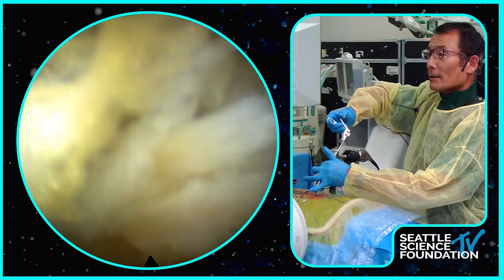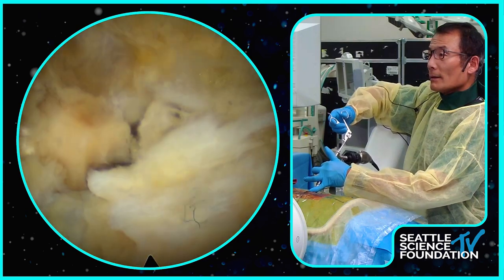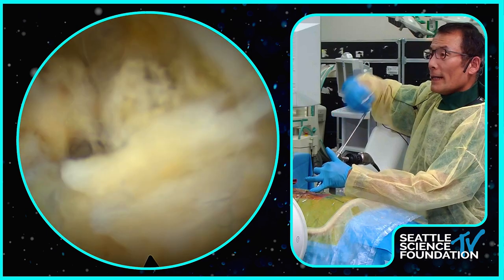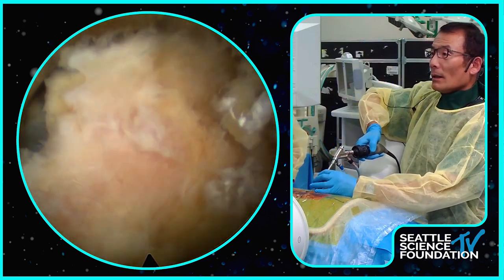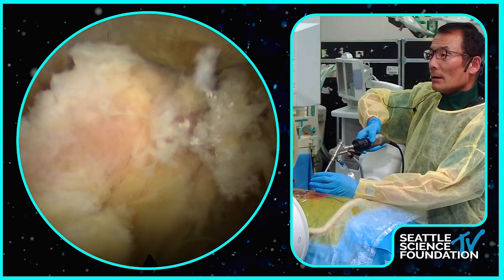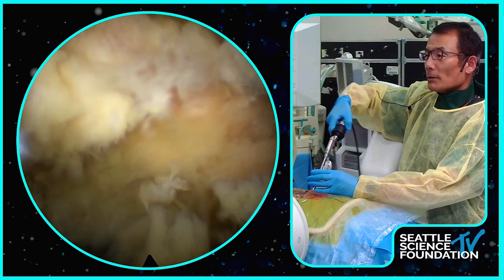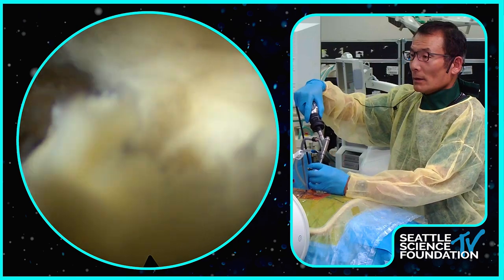Shin, quick question. On your ipsilateral side decompression, you showed us the exiting root. So that meant you resected a fair amount of the SAP to be able to visualize that. Can you go back? Show us the top of the L5 pedicle, if you would, on your ipsilateral side. So we can get an estimate of how much of the SAP you truly resected.